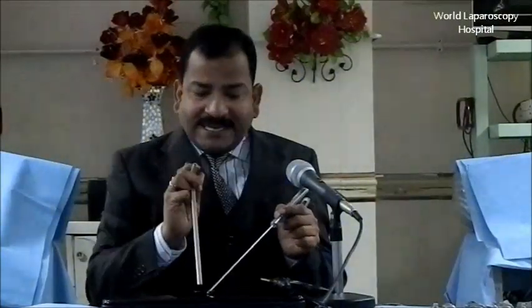A surgeon can never do that. A surgeon cannot bring the hernia into the midline to perform the surgery. The hernia will be there, and you have to put the port according to your target. If your port is wrong, your elevation angle is wrong, your manipulation angle is wrong. Then comes the azimuth angle. Azimuth, A-Z-I-M-U-T-H. Azimuth angle is the angle between the telescope and instrument. That should ideally be 30 degrees.